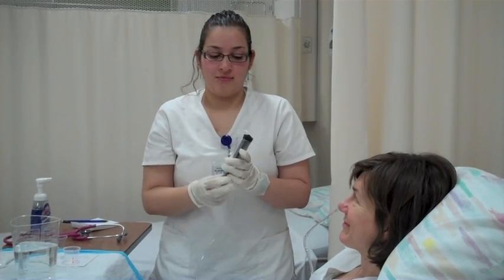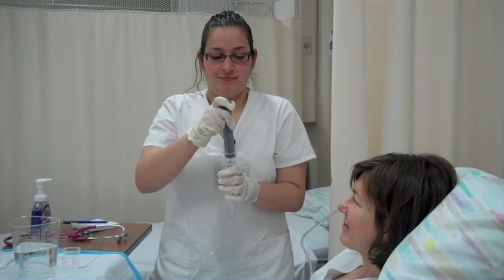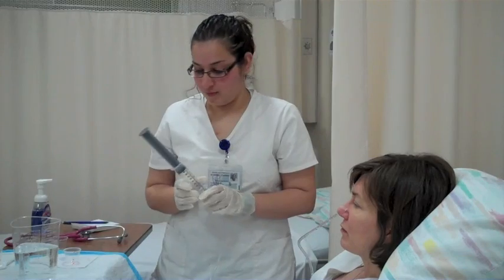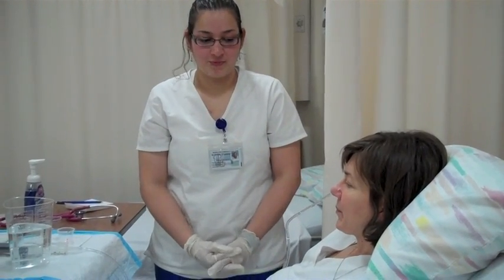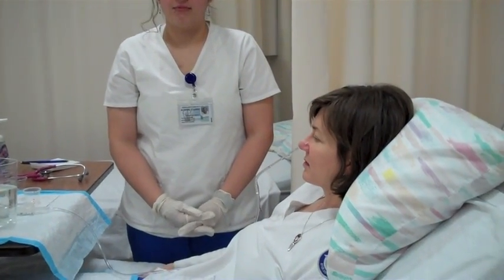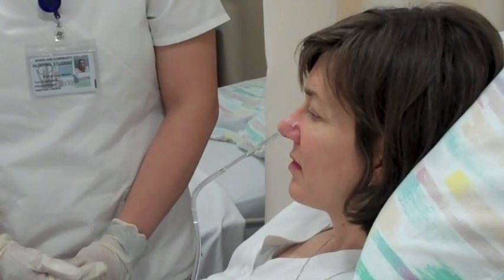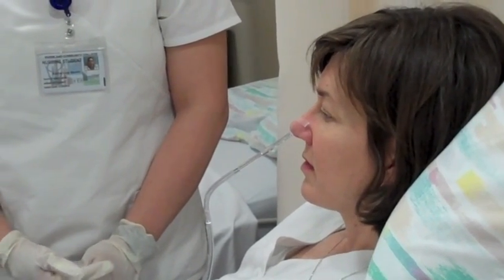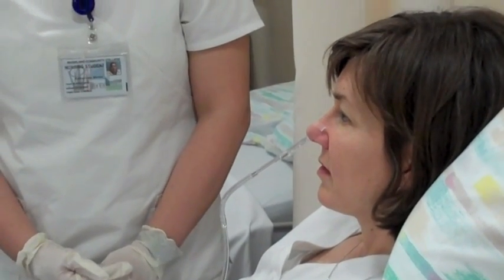The most important things to remember about NG tube medication administration are: A. To check for tube placement to ensure that the meds will be reaching the stomach. B. Flush before medication administration to make sure the tube is patent. And C. Flush after med administration to make sure that no medication is left in the tubing. It is important to keep track of the amount of fluid used during this process for intake and output purposes as well.